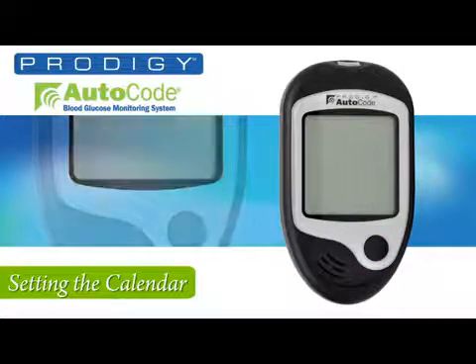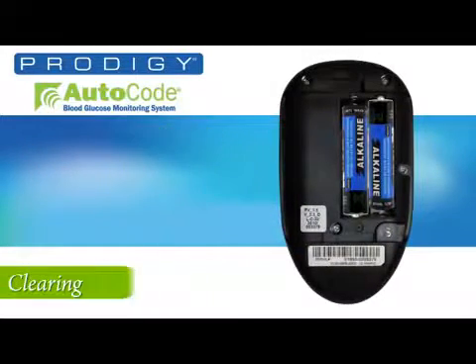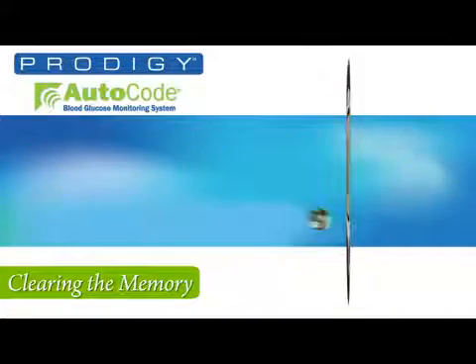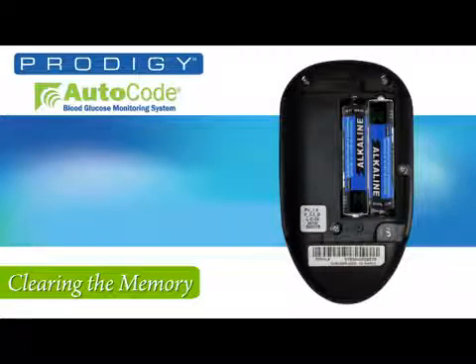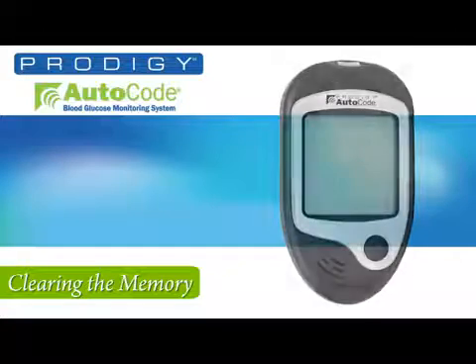The final step before you get started using your meter is to once again press the set button. If you want to clear and delete all of the records, press the M button. If not, simply press the set button one more time and the meter will shut off, retaining your information. Now snap on the back and you're ready for the final steps to start using the meter.